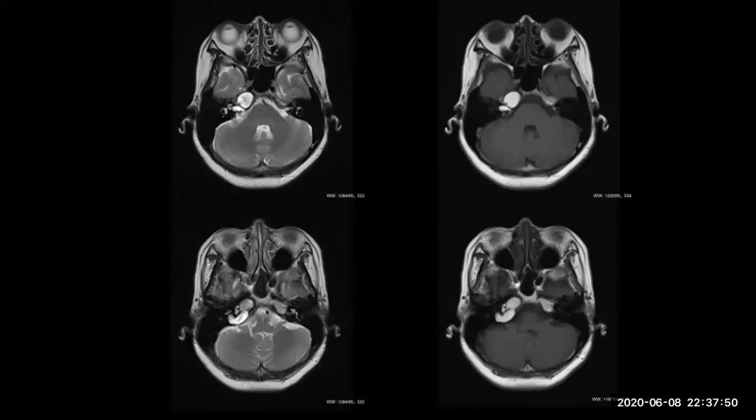Excuse me, doctor. Please go ahead. What about endolymphatic sac tumor? Endolymphatic sac is at the vestibule below, not here. Exactly. Thank you. Doctor, we can't put it in the vestibule.